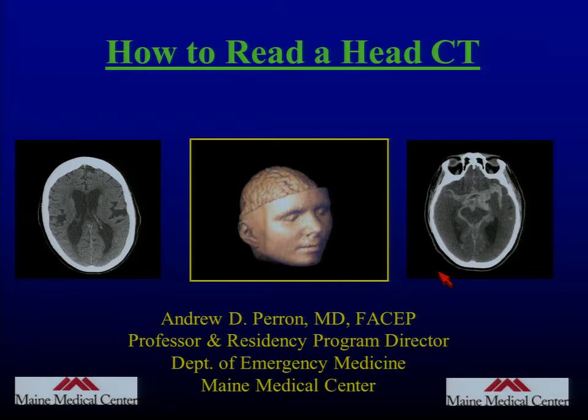And when I went to emergency medicine in '95, there was no mechanism for an emergency physician to look at their own head CTs. This was pre-PACS, and for plain films, they would send back a plain film of the patient. We'd make our preliminary read. But for head CTs, the only thing asked of me was to dial 4614, which is a number burned in my brain, and just listen. And it would tell me what the head CT showed.